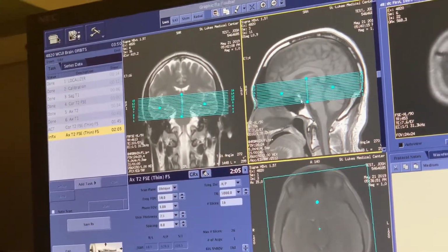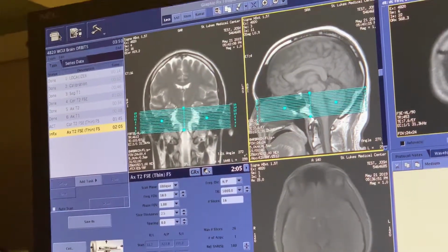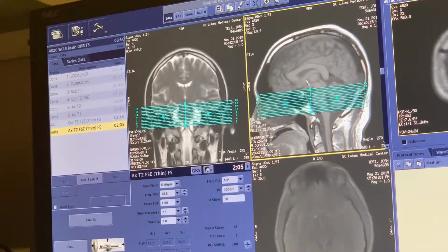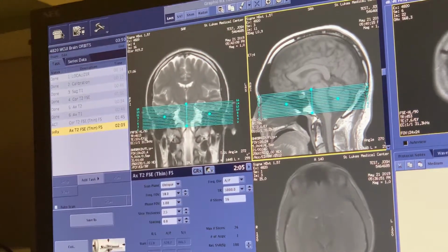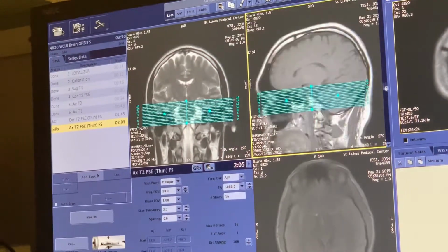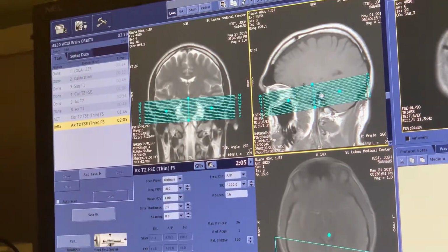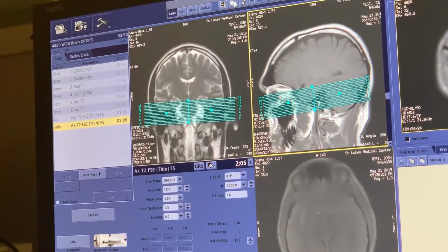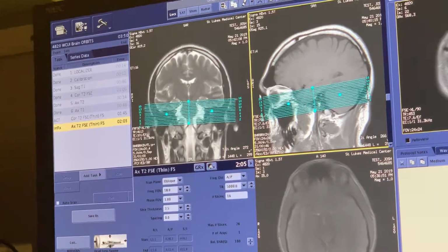So, once again, I'm going to try to match that angle. So I'm going to put either the top or the bottom of this pack so that it goes right over where the optic nerve comes out of the brain. And then I'm going to scroll to the orbit and see where that puts it. Well, we're a bit high, so I'm going to angle it back like this and bring it down just a little bit so that I'm right there. That's the insertion of the optic nerve into the globe of the orbit right there.